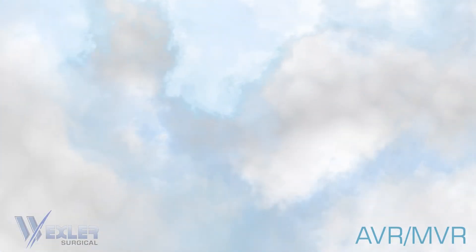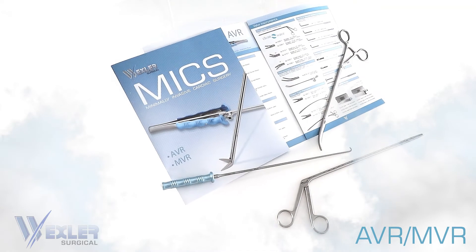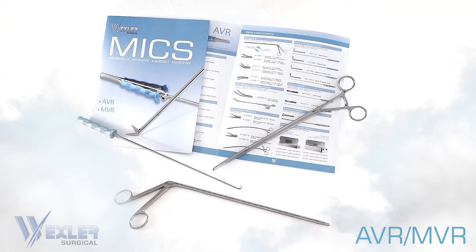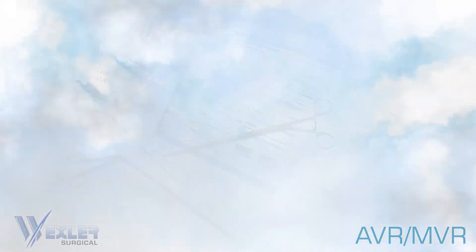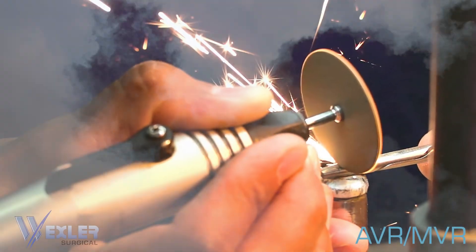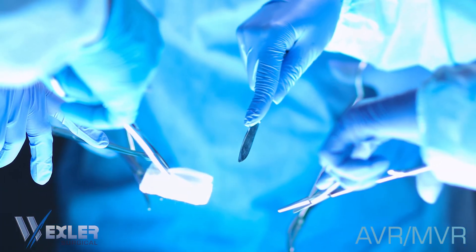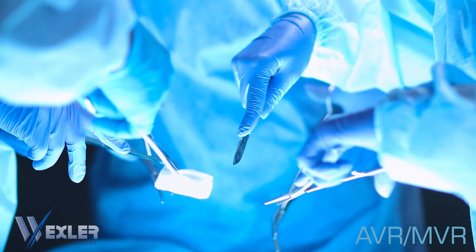Additionally, Wexler offers other instruments that are used in valve replacement surgeries, including rongeurs, hooks, and more. Our instruments are handcrafted using the highest quality materials to become an extension of the surgeon when working on these delicate procedures.